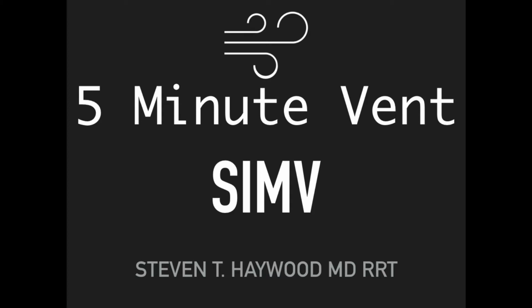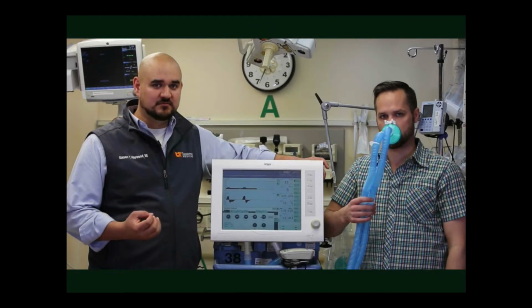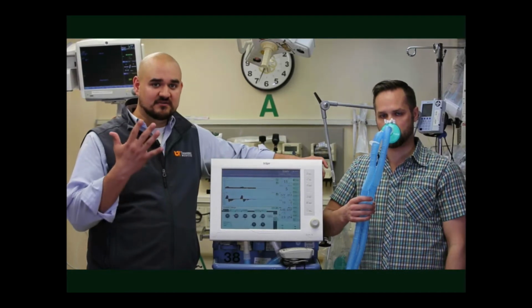So we're going to spend about 5 minutes and talk about SIMV mode of ventilation, or synchronized intermittent mandatory ventilation. SIMV has fallen out of favor with quite a few physicians. However, there's still a lot of physicians that use it, so it's a mode that we need to be familiar with. In SIMV, you're going to set 5 things.